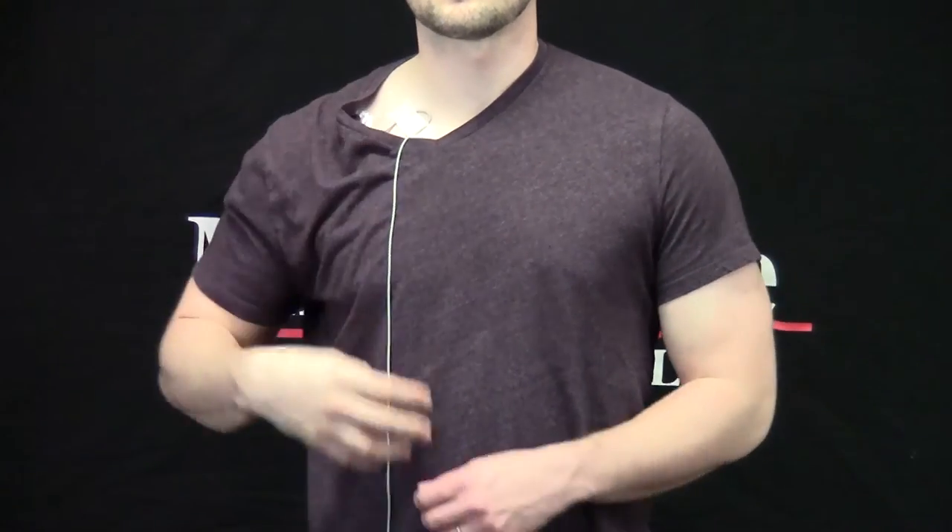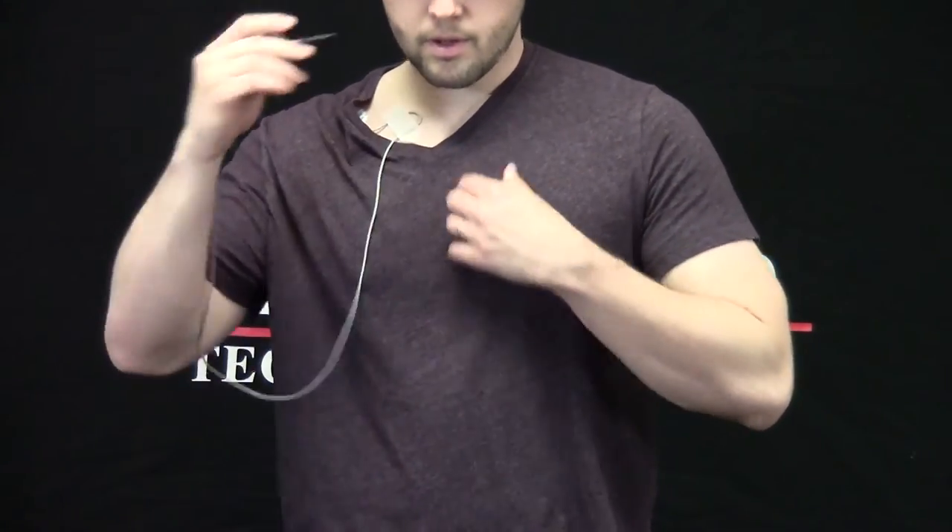Finally, I'm going to ask my subject to release his collar and drop the lead wire down his shirt, because it's generally more comfortable for the subject to have lead wires run through the shirt as opposed to up and out of the collar.